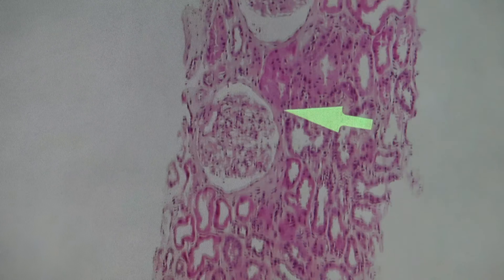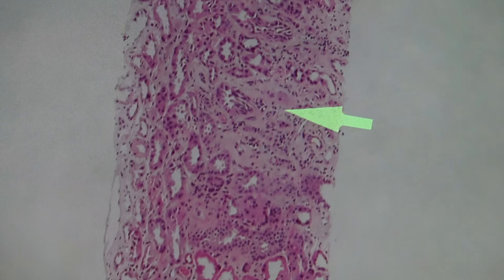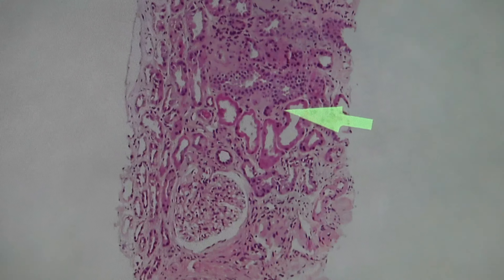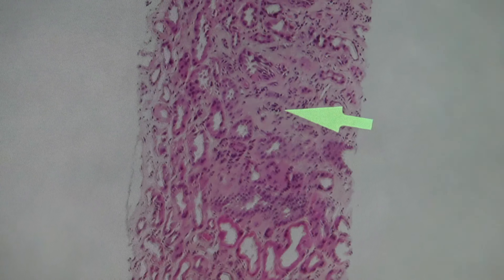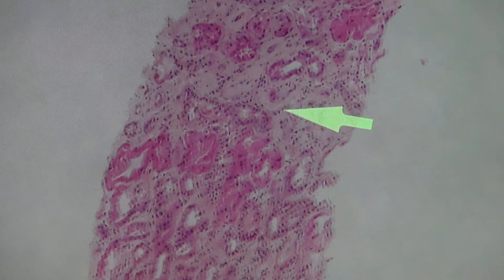Moving up this core of tissue, we're now at the corticomedullary junction and there are four glomeruli above here. You can see that the interstitium is scarred, but on this stain it's really hard to figure out exactly how much of the interstitium is scarred. In your mind you can't see a clear demarcation between the scarred area of the cortex and the unscarred area. These are the glomeruli.